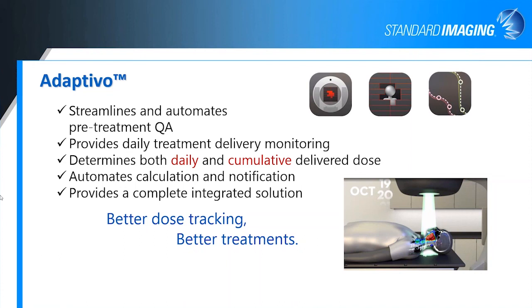And the question that I see is the adaptive module CBCT, is it MV or is it KV? It's KV cone beam CT.